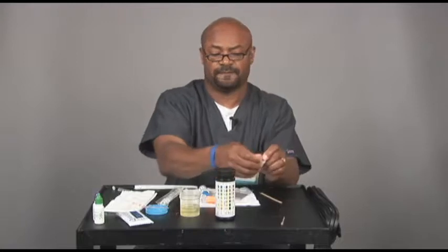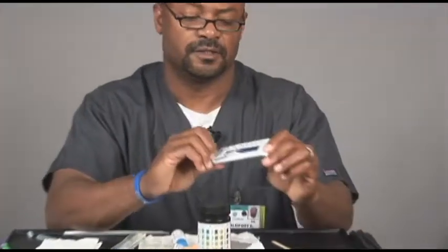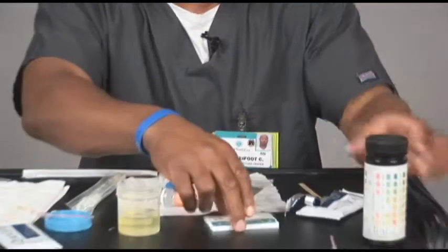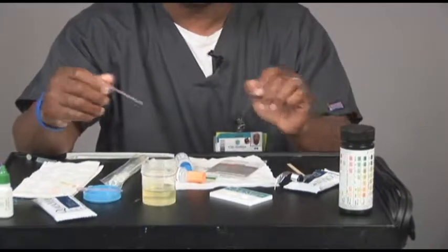Next is urine pregnancy test. And normally it comes in the blue and white quick view test. Again, you would need urine, properly labeled with patient identification, and you would need a pink dropper for that.